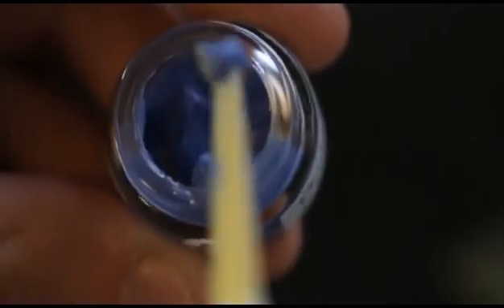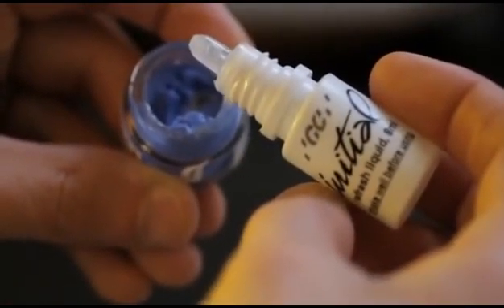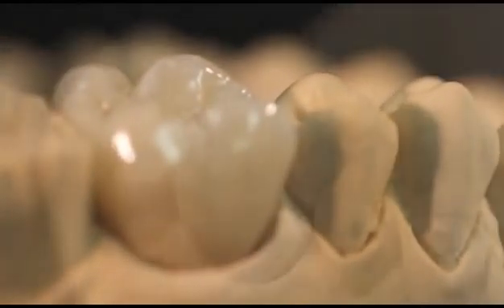Lustre Paste Refreshing Liquid: used to preserve the thixotropic property of the paste. This liquid is used to recover dried-out paste to an optimum gel-like consistency. The refreshing liquid can be used both in the jars and mixed on a separate plate. Please see the Initial IQ Lustre Paste NF Manual for more detail. Beautiful result in just one firing.